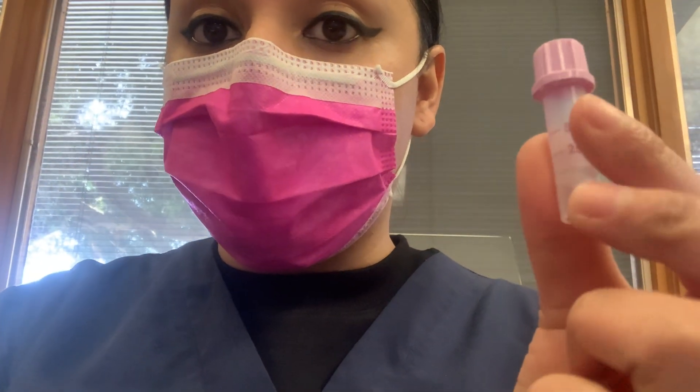I always take the extra step — I use a warmer and I poke with pressure. I keep repeating that because you don't want to poke the patient twice. If you poke the surface, you'll get no blood flow. You need blood up to the second line — sometimes you need at least 10 drops or more. If you get a tiny little drop, the specimen will either get hemolyzed or clotted and get rejected.